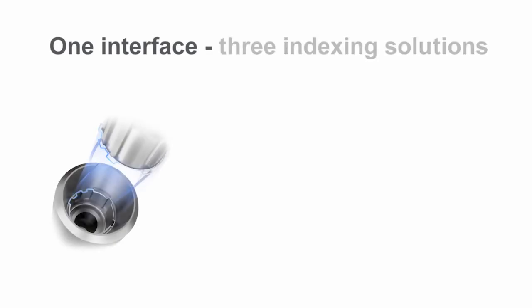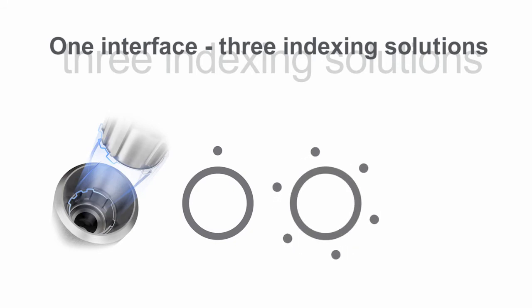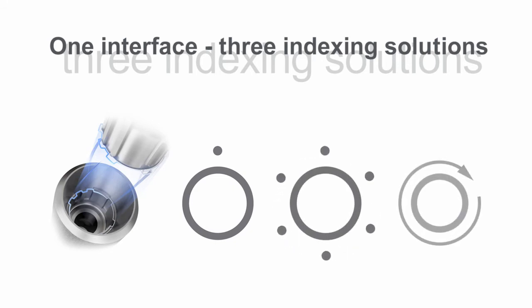One interface, three indexing solutions. In addition to the one-position only placement, the interface design also allows for flexible six-position indexing of prefabricated abutments, while index-free abutments can be seated in any position.